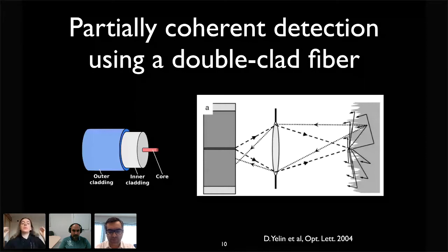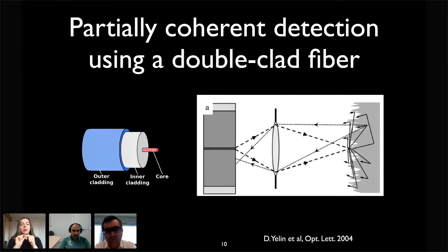And one of the problems that we had was that in order to preserve all the properties from the laser, light could only be carried by a single mode core, so a part of the fiber optics that is very, very, very small. When it hits the tissue, and when I say tissue, I mean any organs. It can be the esophagus, the stomach, any type of human material. It's not like a mirror. You don't have a straight reflection back into this very small core.